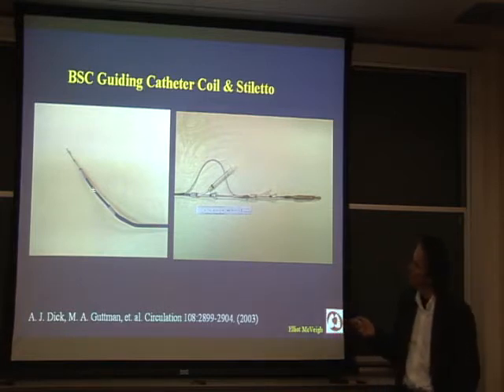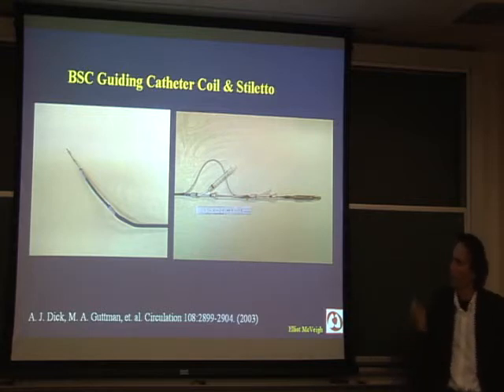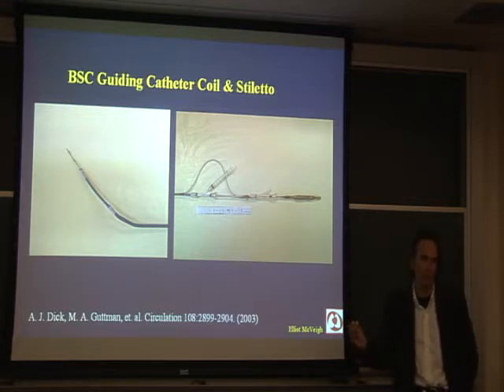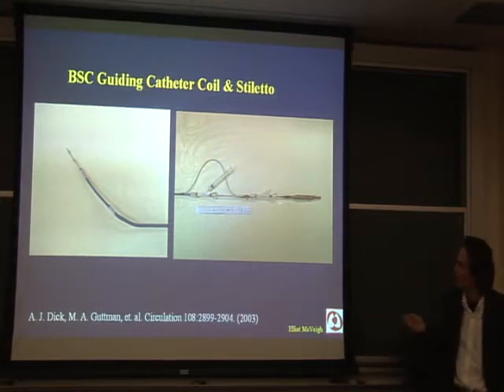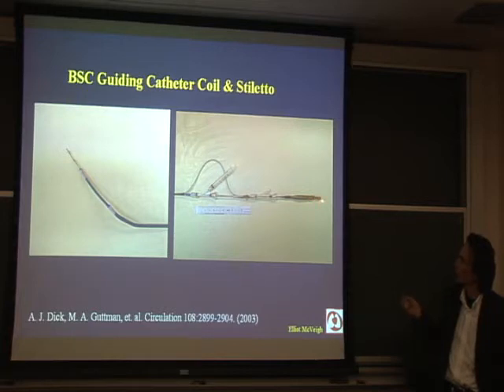There is also, on the shaft of this catheter, a thin wire that acts as an MR receiver coil, so that we can see where the entire shaft of the catheter is. There's also a little coil around the tip that's fed into its own receiver. It can be reconstructed with a separate color to show you where the tip is. The receiver plugs in down here. There's a little preamp that plugs on the end here, and then goes off to the receivers.